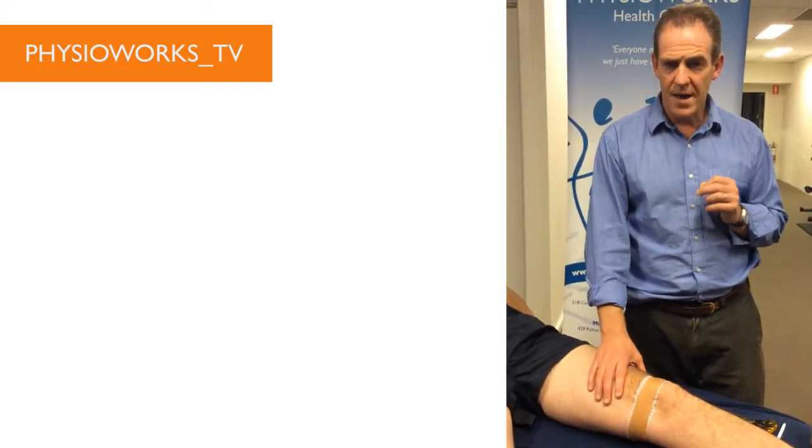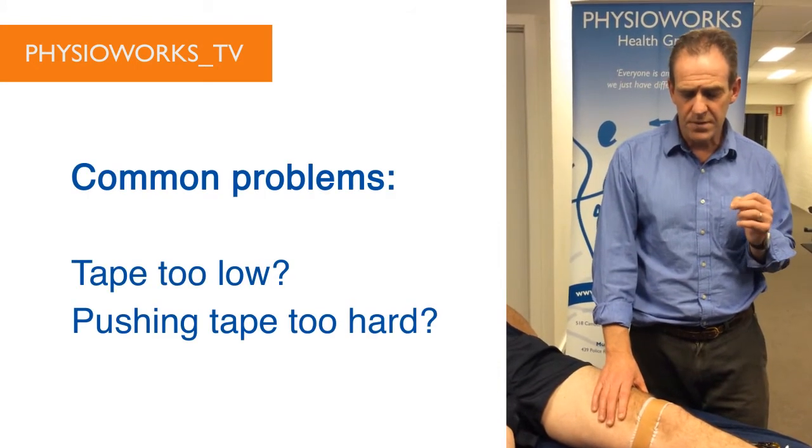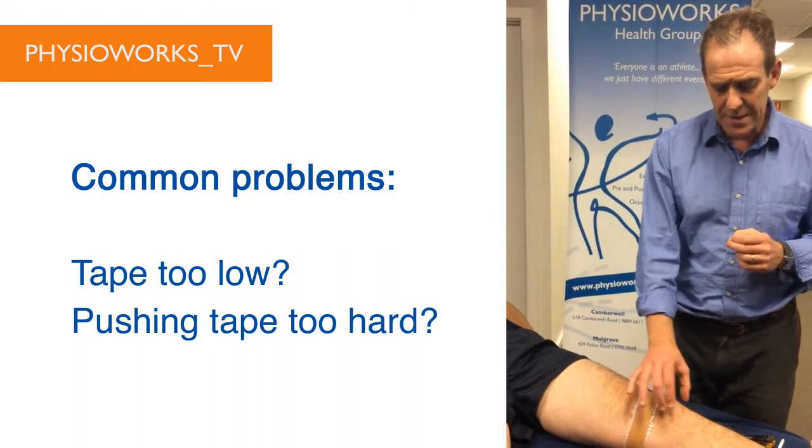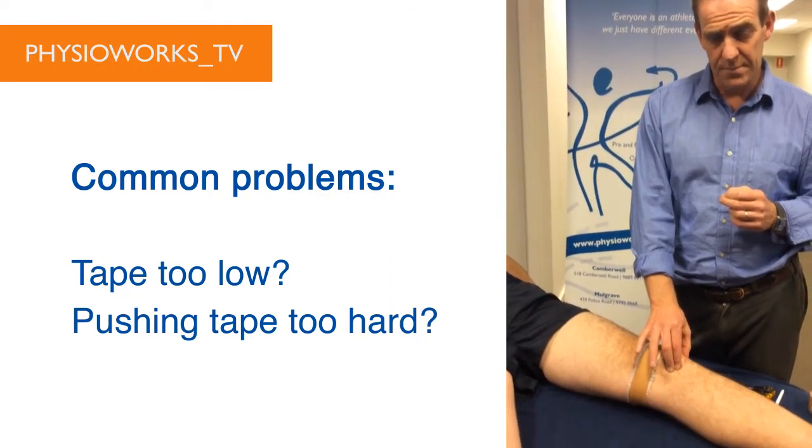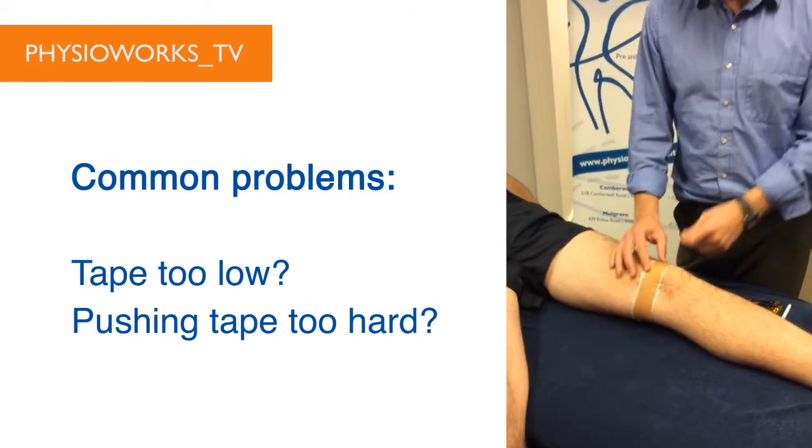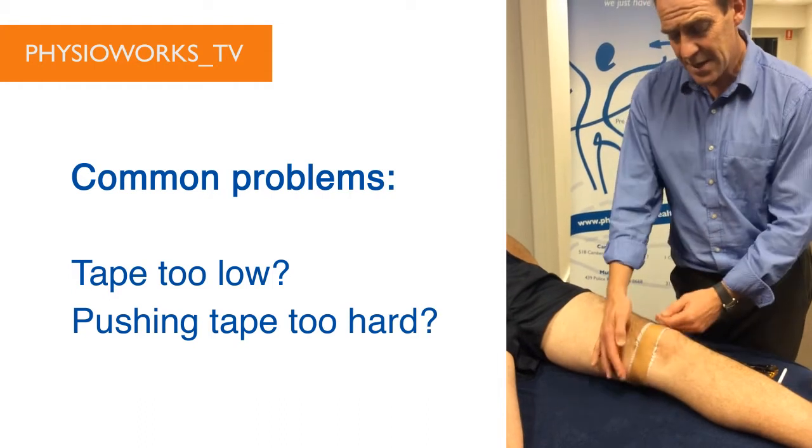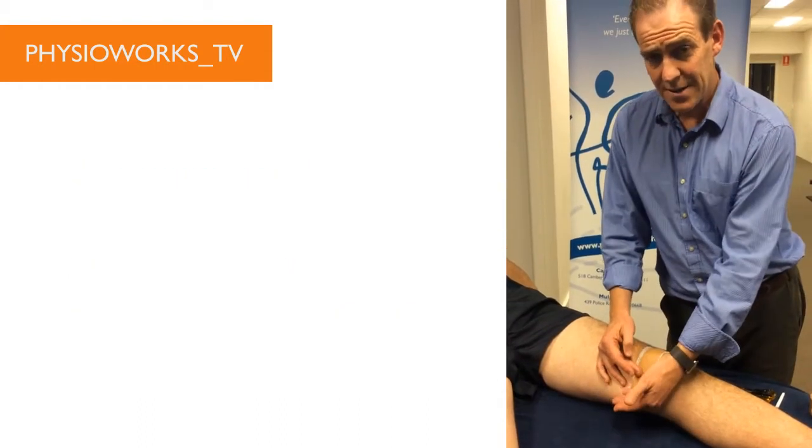Common problems we have if you haven't achieved what was achieved in the treatment taping protocol is that you tape too low on the kneecap, so you tape in the bottom half. The other issue is that you push the kneecap too hard across with the tape. Once again, lift up and just lay it down.